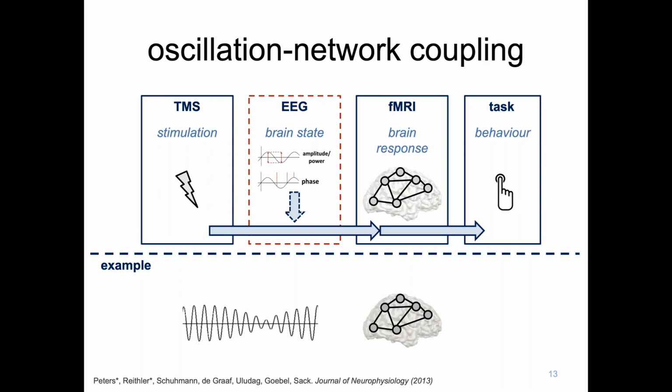So we could now do an experiment where we test what happens if my TMS pulse that I apply to the network happens to be applied at a moment when, for example, the intrinsic spontaneous power, so the amplitude of the alpha oscillation is high. Maybe then, because alpha is used to inhibit information flow, so if alpha is high, maybe then the signal that I send into the brain is not spread out, is not propagated. Then maybe your TMS effect will be very limited, only to the area that you target, and it's not spreading around the network because the power of alpha is high at that moment and is thereby inhibiting the propagation of your TMS pulse.